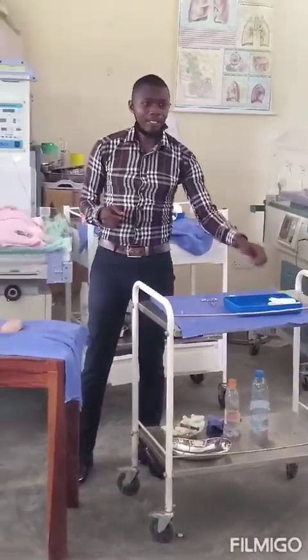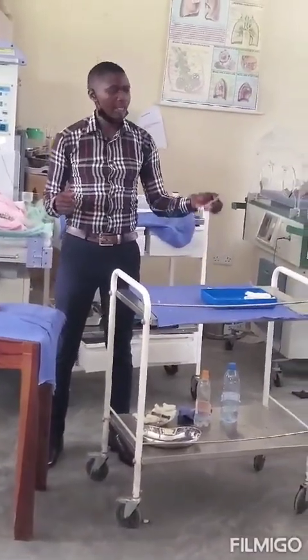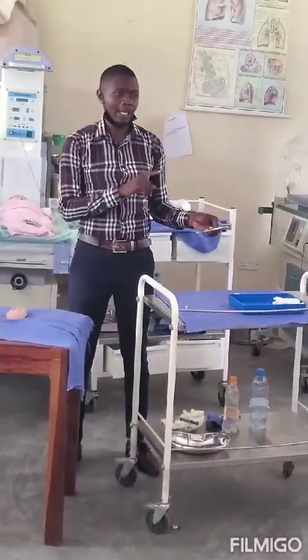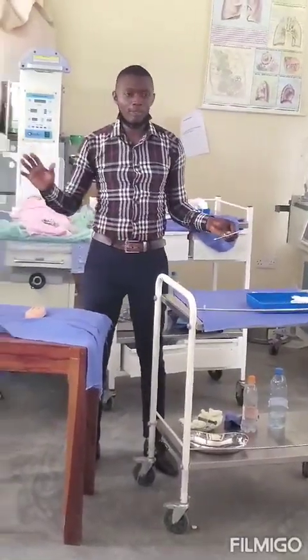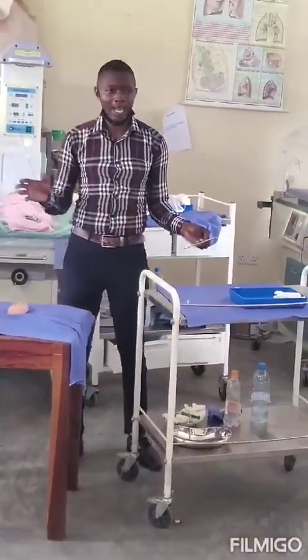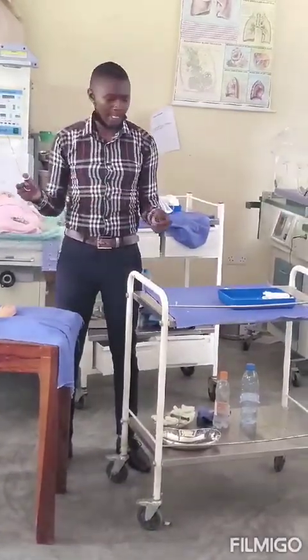So you are going to pick this dissecting forceps that you dropped and use it to pick this forceps with the suture. So you see now why we had to place the suture in advance. Yes. Because at this point, this hand moved away from the field. So it will be impossible for me to put them together because I can't do it with one hand. So just pick this and pass it on to this hand like that.